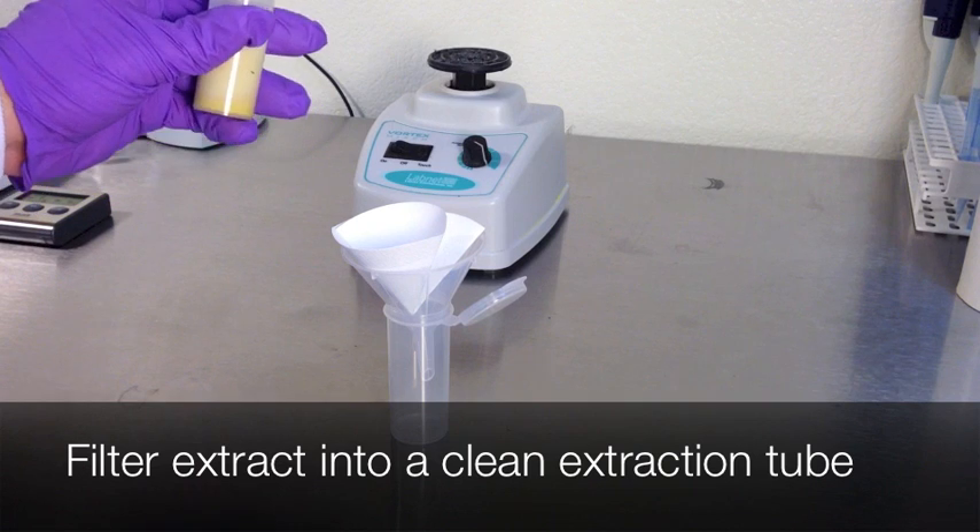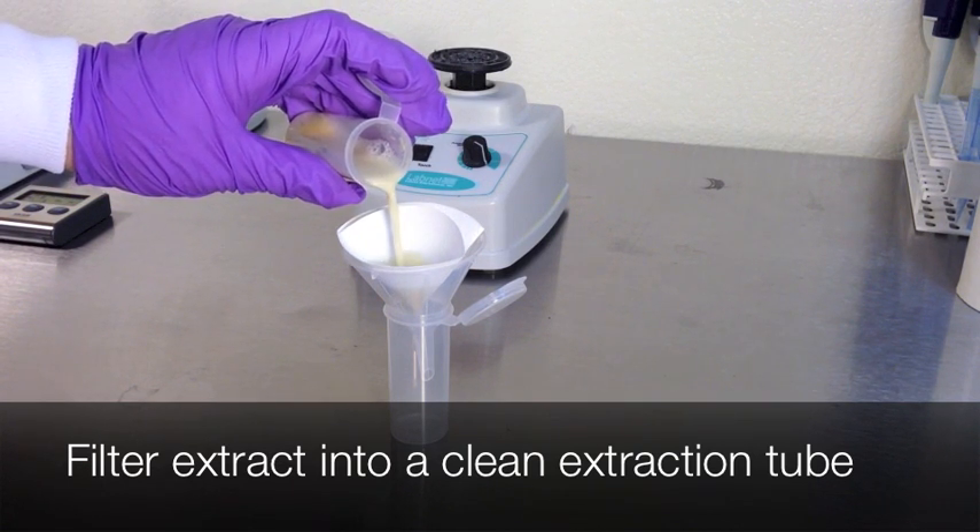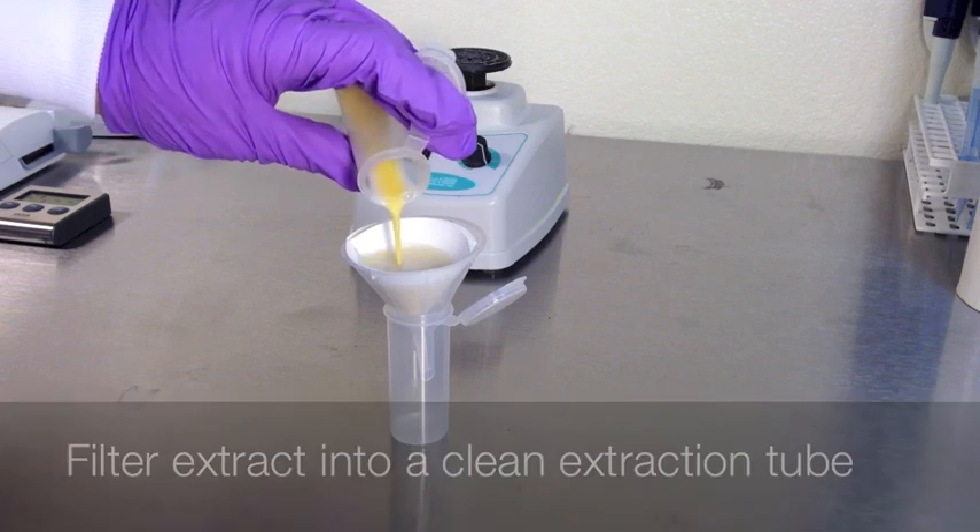With a disposable paper filter and reusable funnel, filter the extract into a new disposable extraction tube.